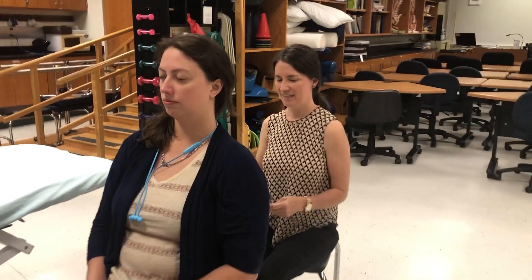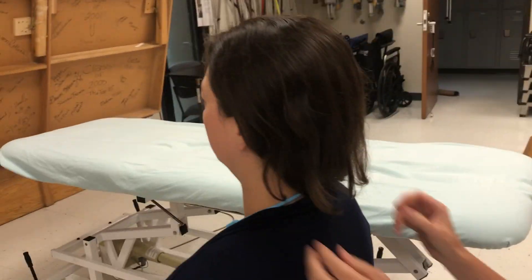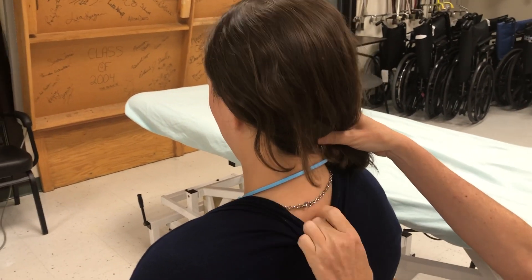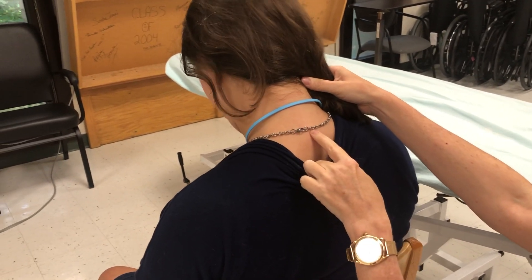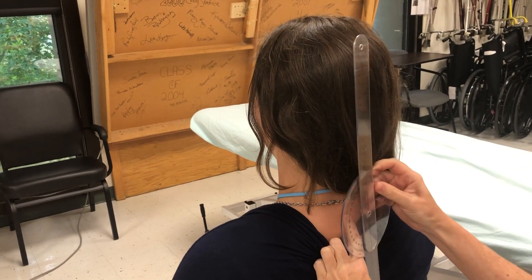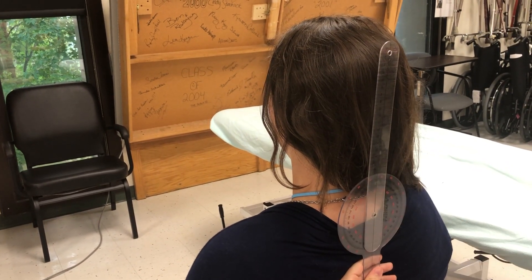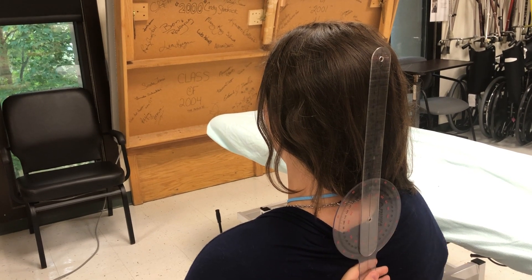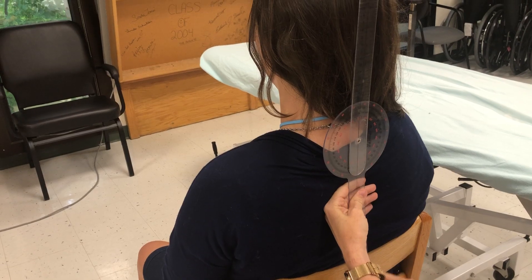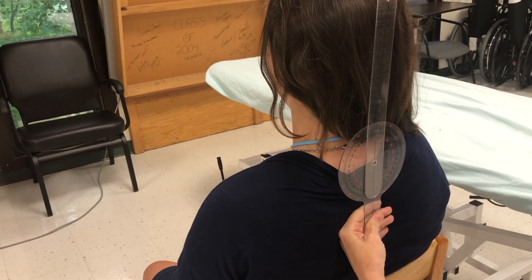I'm going to go to the back of the patient to do this measurement. The first thing I need to do is find the spinous process of C7 — I'll ask the patient to bring their chin to their chest to identify it. I line up my fulcrum with that point and my stationary arm is perpendicular to the ground. It is not lined up with the spinous processes of the thoracic spine because someone could have scoliosis.